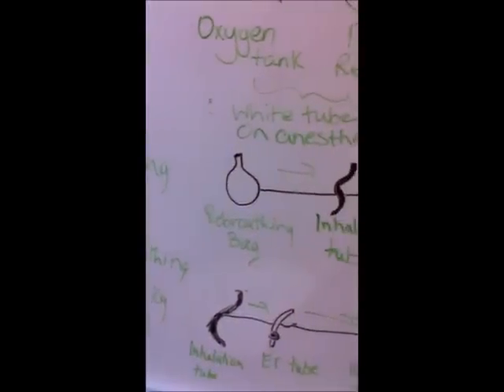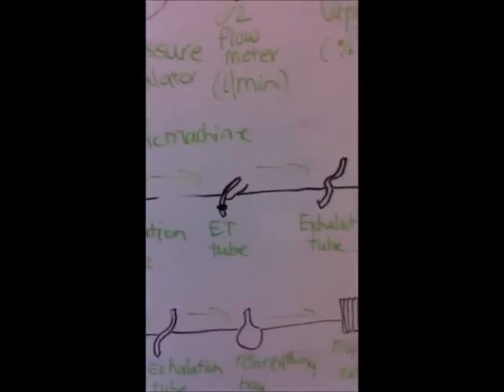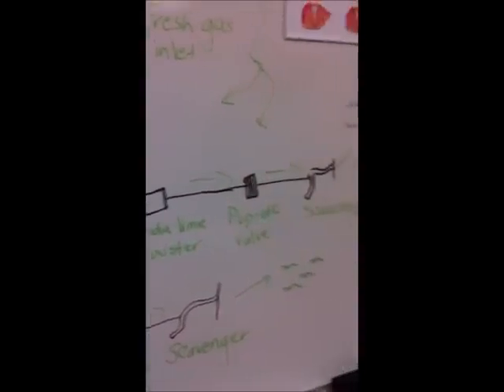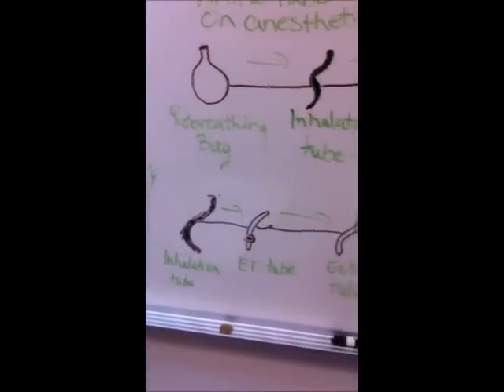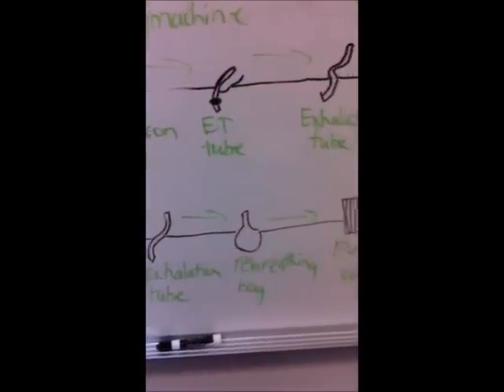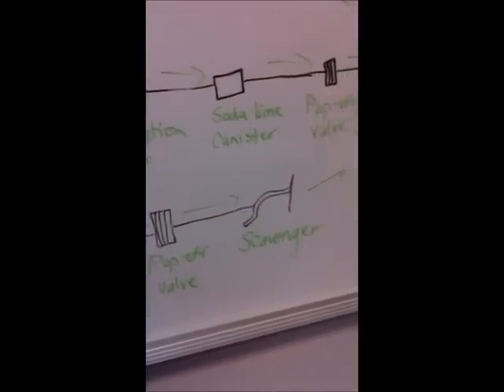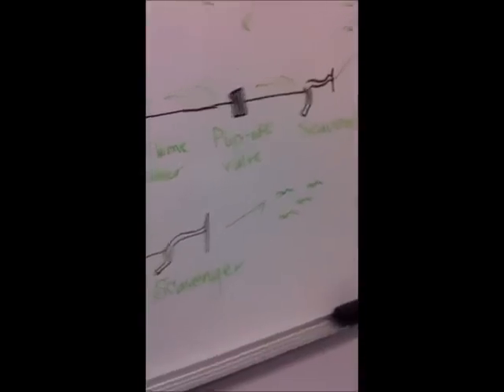On the non-rebreathing one, you're under, right? Right. And then rebreathing, you use over. Right. To me, in terms of your practical and what you've got to figure out on that, that's one of the easiest things, because it's simply that. I'm going to give you a case that's got a weight on it. Look at the weight right away. Oh, rebreathing system, non-rebreathing system. That's easy. The hard part is making sure you get the right things hooked up to the right things here.